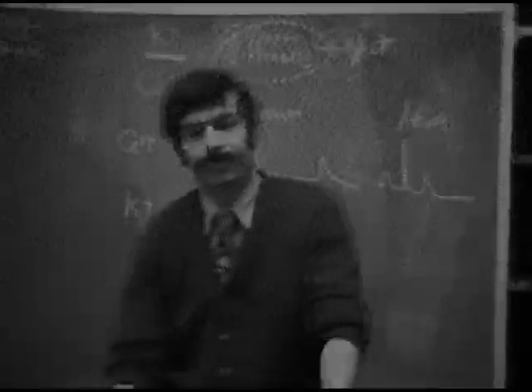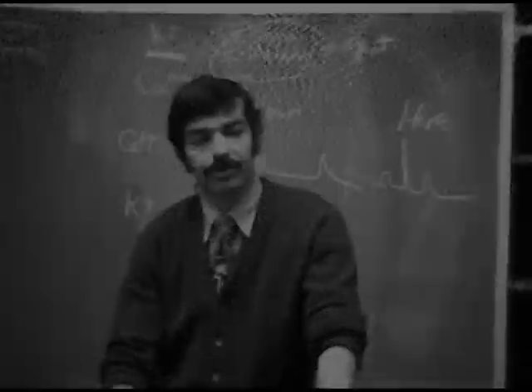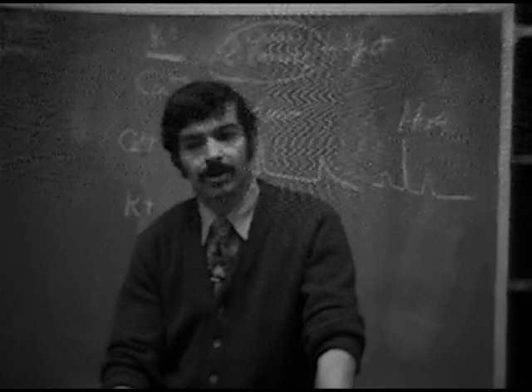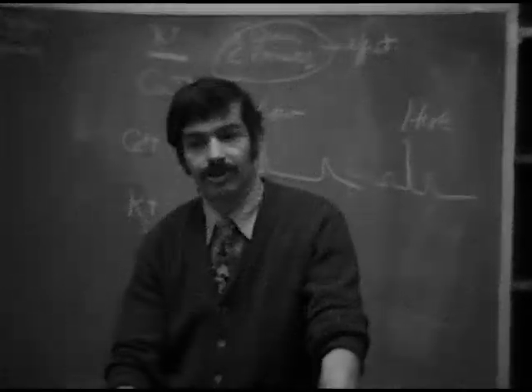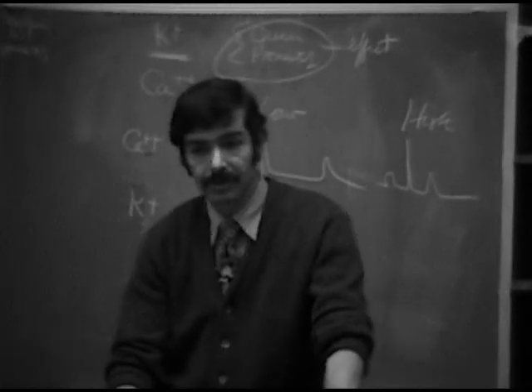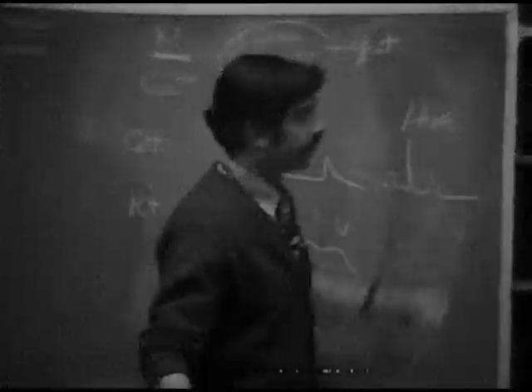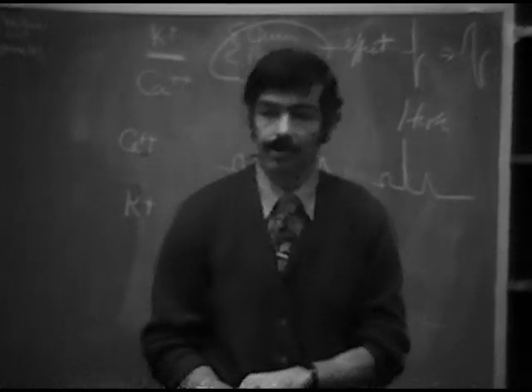Okay, what's the effect of quinidine and procainamide toxicity? We talked about this earlier. See if we can review that point. What do you see with quinidine and procainamide toxicity? Prolonged QRS. Right, prolongation of the QRS duration, or intraventricular block. So this is the quinidine procainamide effect, whereas with quinidine toxicity or procainamide toxicity, you wind up with prolongation of the QRS, or intraventricular block. The QRS just spreads out.